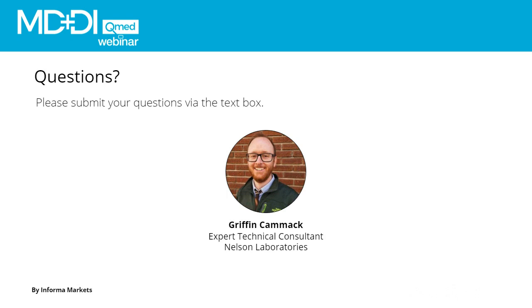Now, just to further expound on that, the key question to ask yourself is the likely contamination. You don't necessarily want to think about worst case, because you can really kind of dig yourself into a hole and do some testing that is just not needed for your device. So you really want to look at what your device is intended to be used for and what is the likely contamination, and then make your determination based off of that.